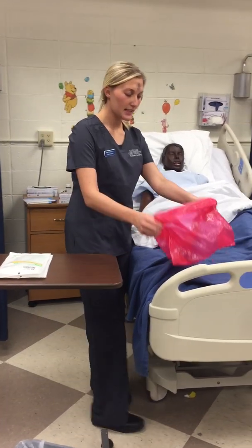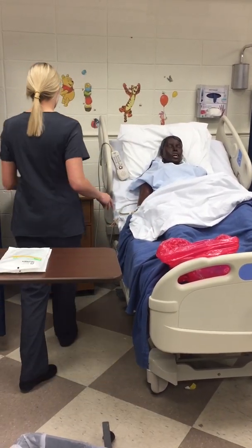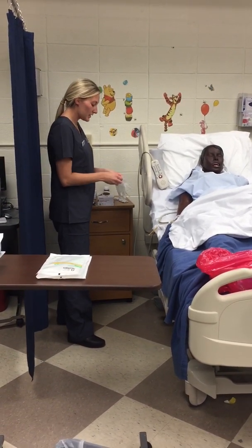Mr. Jones, we're going to be setting some things down by your feet. Stay still. Okay, perfect. I'm going to go ahead and pull the curtains for some privacy. Go ahead and get some clean gloves.